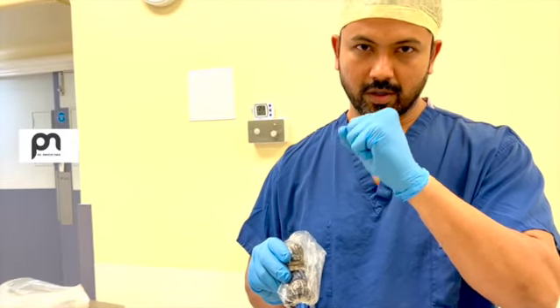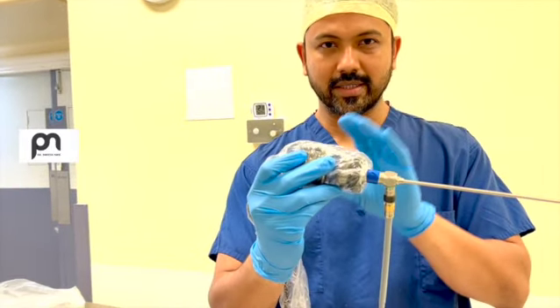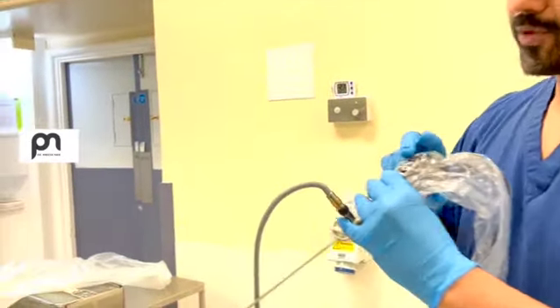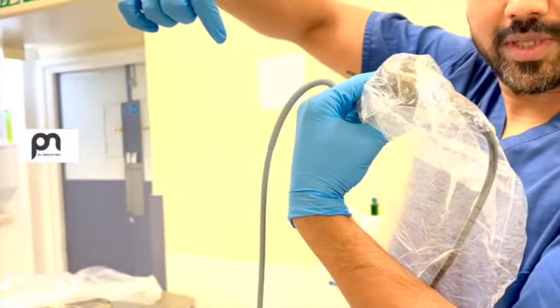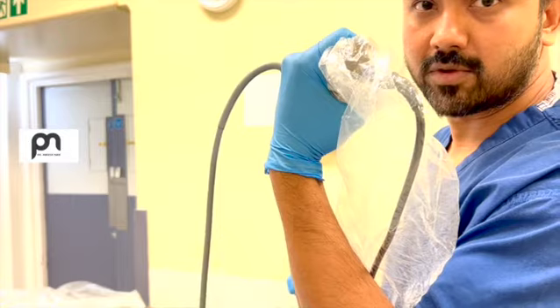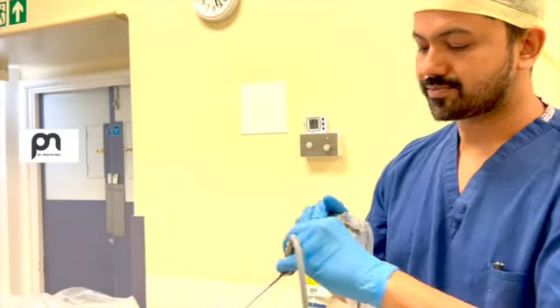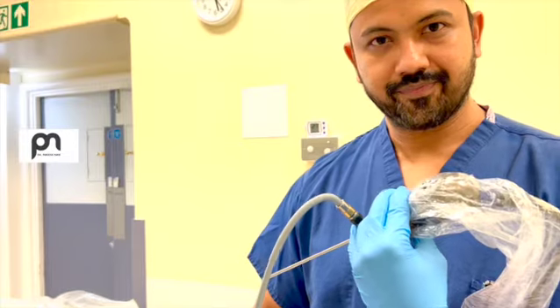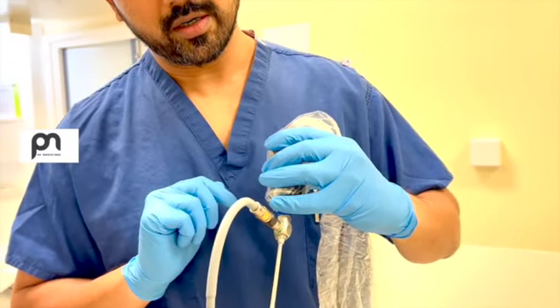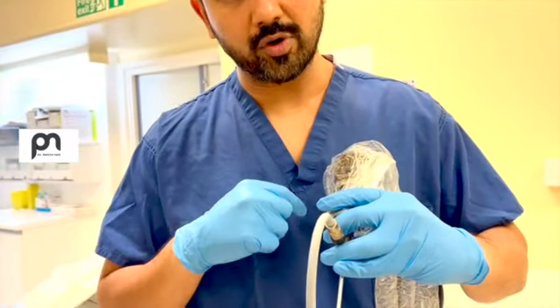Don't grab it. Okay? So if this is the camera head, there are different ways of holding it. One is you can just hold it like this. What happens is, let me put it in the proper position. When you're holding like this, there's a gap you can see over there. So I'm not using palm or gap. I'm not holding it like I'm going to stab someone. No. It is a delicate touch. Can you see this? Okay? So hold it this way. You can keep your finger over here or over here, everything above the cable, or you can hold it this way as well. I'll tell you what are the drawbacks if you hold it this way.